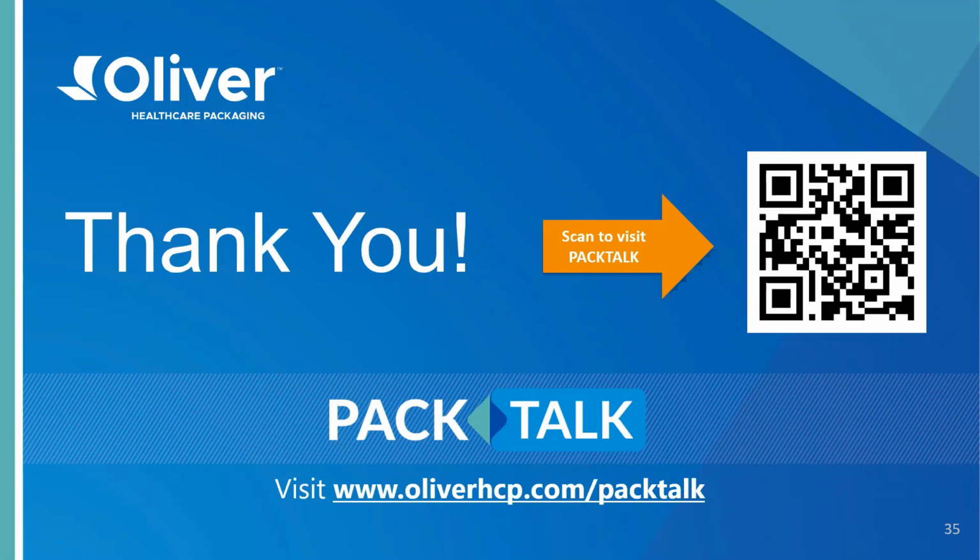I can take that one if you want, Jeff. So kind of in the design control, initially, well, this is my opinion of course, but initially you want to do a formative study, and for me that'll dictate how often you need to engage with the end user. So once that information is gathered from the formative study, and once it's locked in and implemented, then it's time to refer to the summative study, to ensure that the device meets form, fit, and function, really.